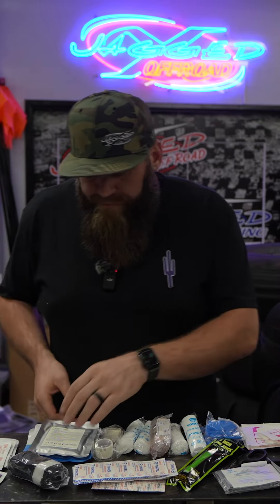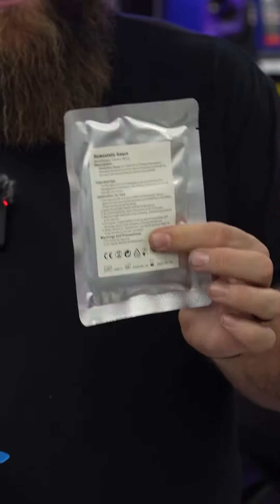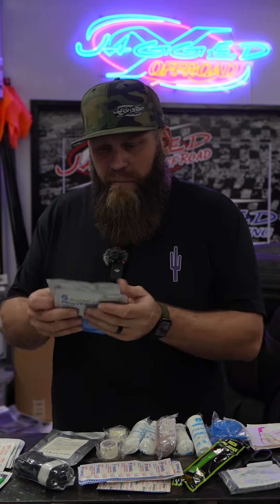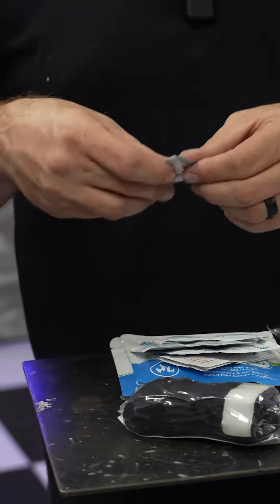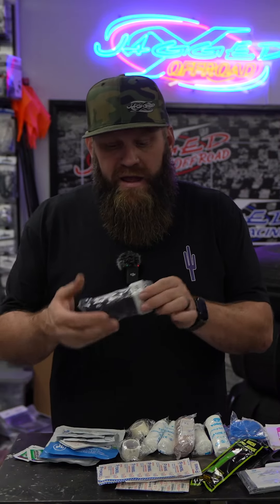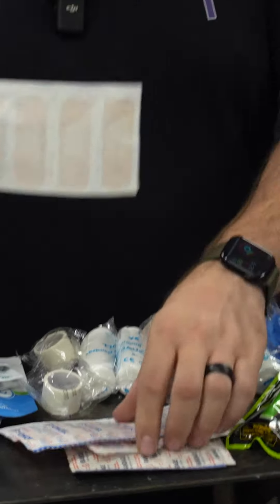Going through everything real quick — this advanced first aid kit comes with a gauze kit specifically for chest wounds, burn relief gel with a couple of packets, and a lot of different pads including sting relief pads, alcohol prep pads, and antiseptic wipe towelettes. It also has antiseptic ointment, a tourniquet, and a blank spot with a pen so you can write the time on it to track how long the tourniquet has been on.